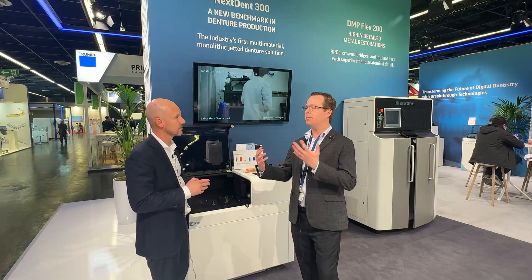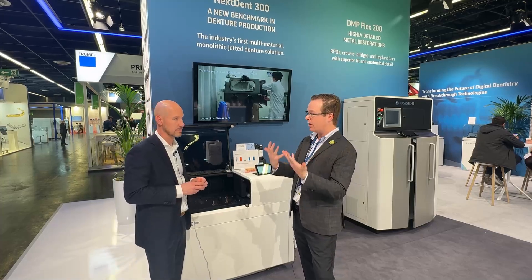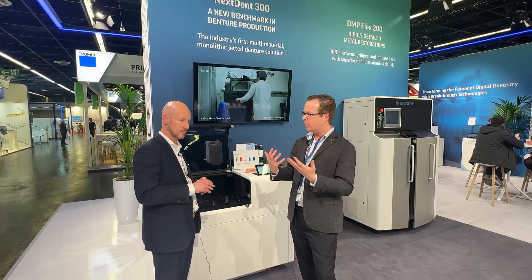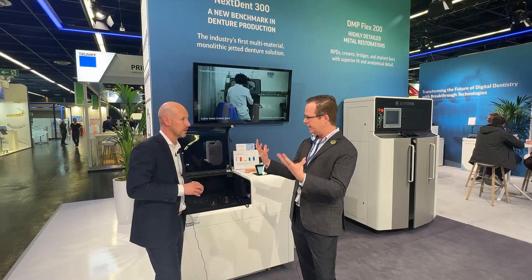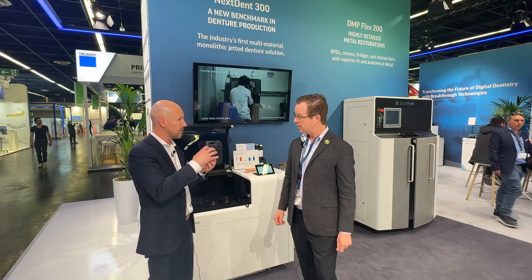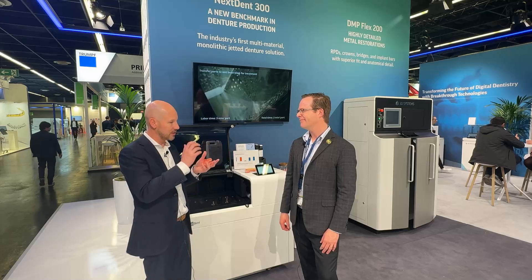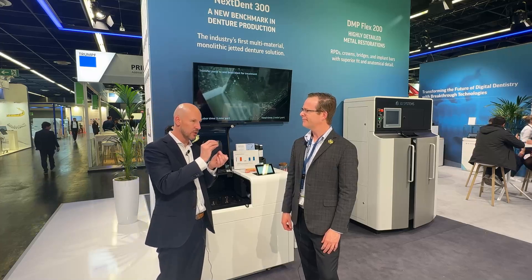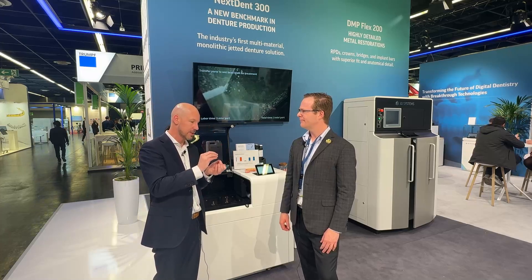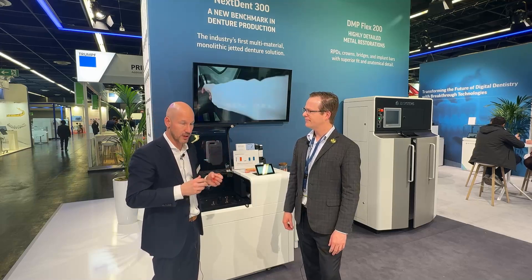So essentially walk me through the process. I scan my patient, design it or use an automated AI system, etc. All you need is the STL input of the base and the teeth — preferably the monoblock — just to make sure that everything stays together. The design requirement is that the base and the teeth will have a zero gap, absolutely no air gap between the teeth and the base, so that we can get a complete monolithic build.